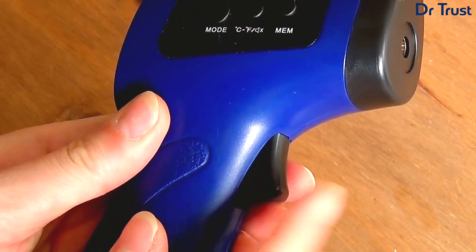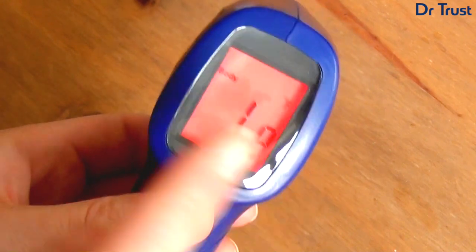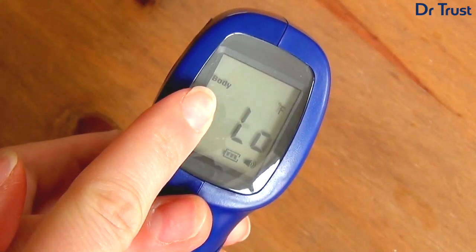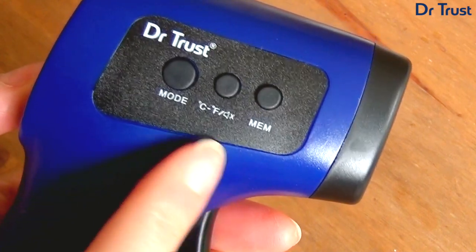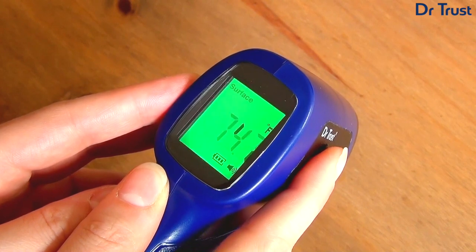To get started, choose your mode of measurement by pulling the trigger to turn the device on. The device automatically turns on in body temperature mode, but if you'd prefer to measure the temperature of an object or a surface, simply press the mode button to switch.